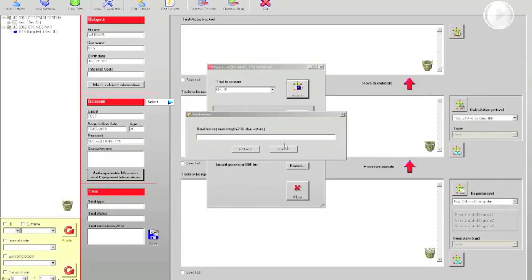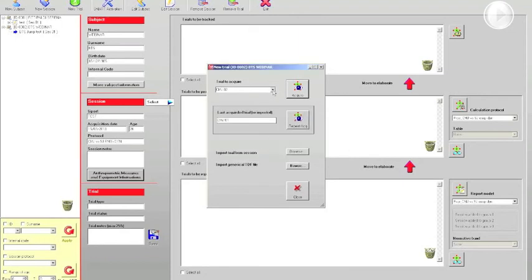We save the data, we still have our tab to add some notes, and now we switch over to the squat jump, the first one. Of course, we can do more than one counter movement jump and more than one squat jump, and then at the end we will get both the jump by jump analysis and the average attitude of my subject. So for example, if we want to make a real test, we should have performed 3 counter movement jumps and 3 squat jumps, so we have the certainty that the data will be repeatable. But in this case, we go for the squat jump.